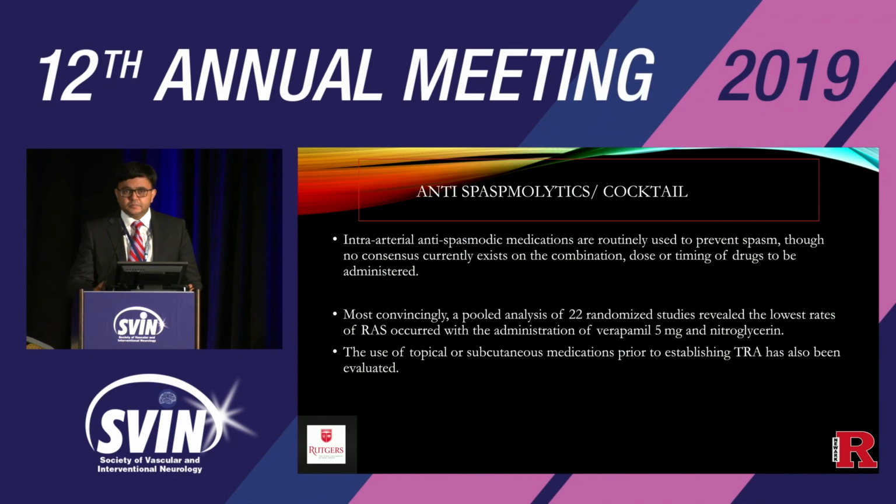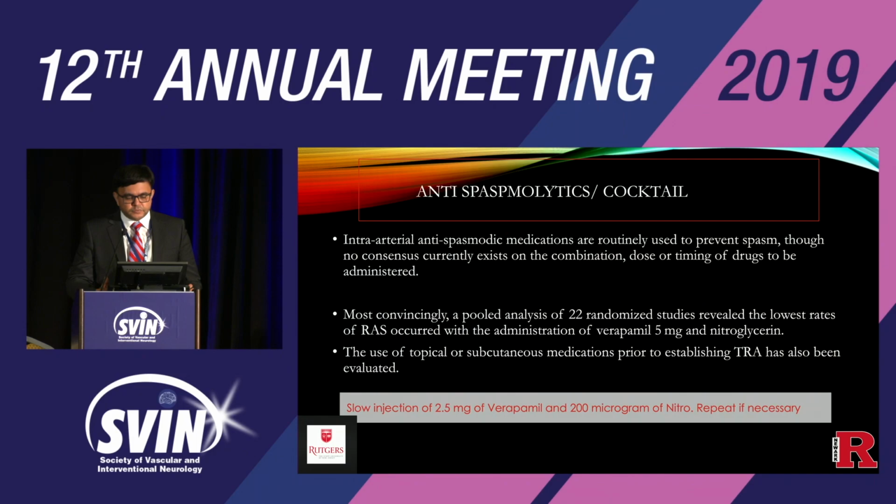What cocktail to be used? I've been asked this question a lot of times. Again, the data is all over the place. We use 2.5 of verapamil and 200 of nitro. You can repeat the doses if necessary. As long as the pressure is stable, there's absolutely no harm in repeating as many times as you want. So I have sometimes given 10 milligram of verapamil and 400 of nitro.